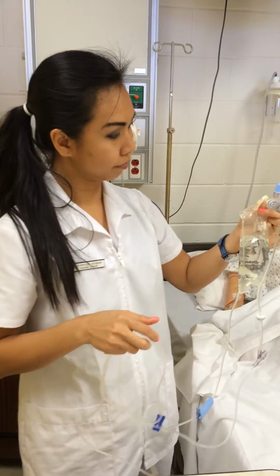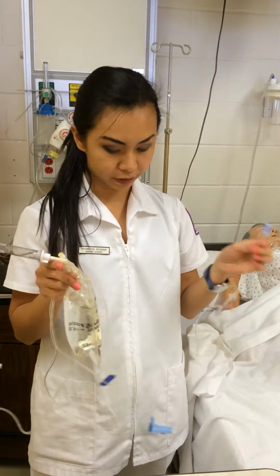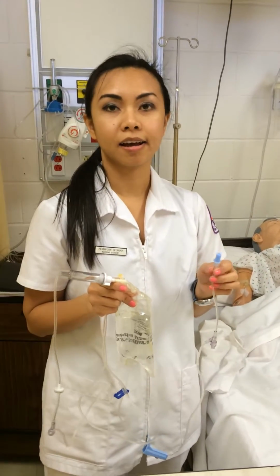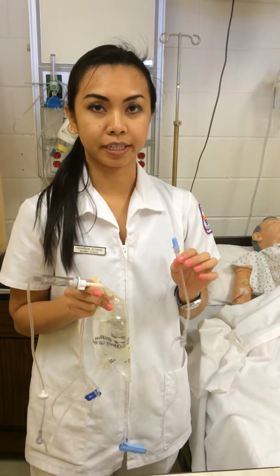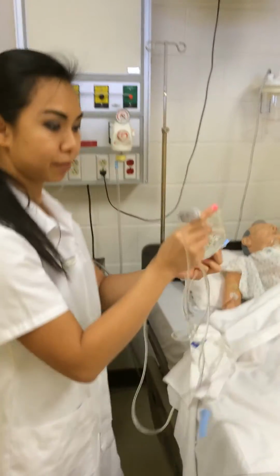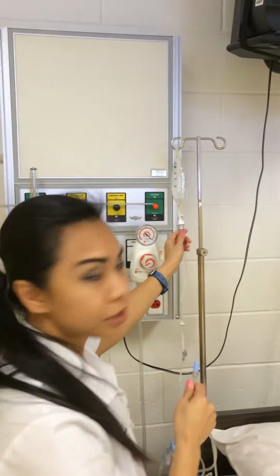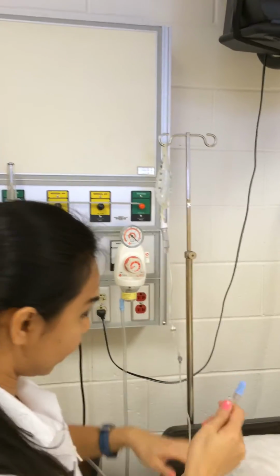And I calculate the drip factor from the physician order. It's going to be 60 drops per minute, so it's going to be 15 drops per 15 seconds. I'm going to hang it. I fill the chamber halfway, and I am going to prime the tube.